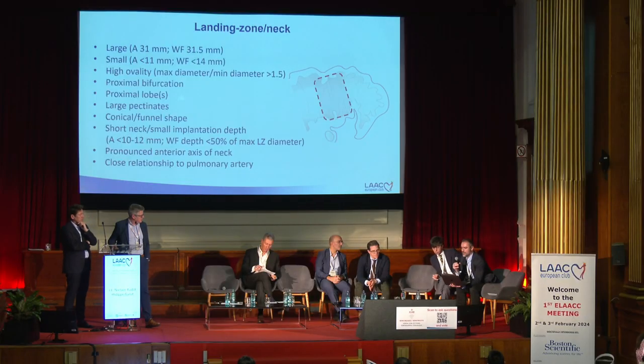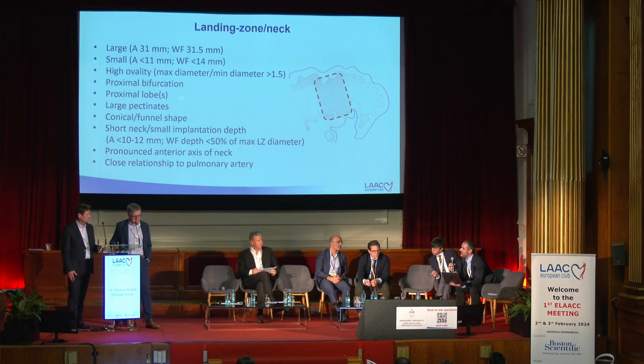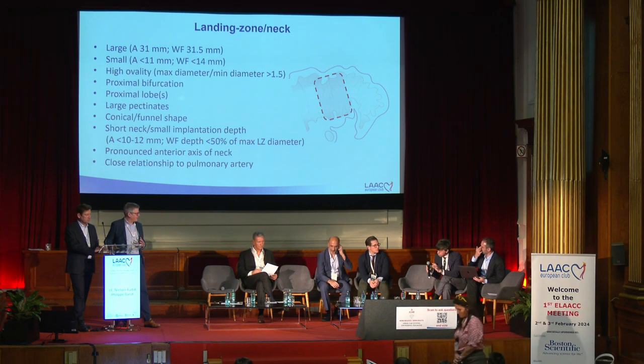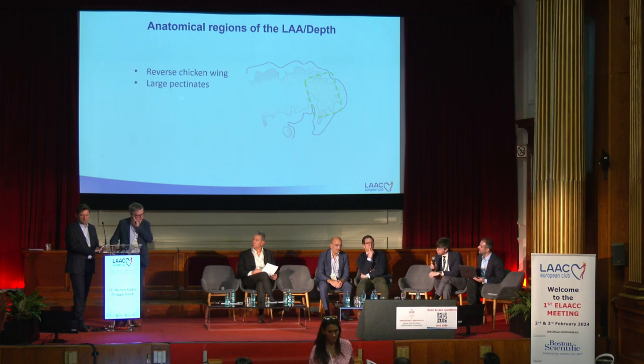In essence, Erik, at the end, you said that we have to be simple but also comprehensive. The thing is, all these factors are just to tell if the ostium is easy or not, if the landing zone is easy or not. If the landing zone has none of this, it means that it will be simple. So that's the goal of this classification. Because here it looks very difficult, since there are a lot of factors. But at the end, what we're looking for is whether it's going to be yes or no. Is that correct? Yeah, these parameters I will show you should tell us about the complexity of the procedure. That's one thing, and they should also try in some way to predict some of the risks that can be associated. But we can come back to that because that's part of the classification as well.